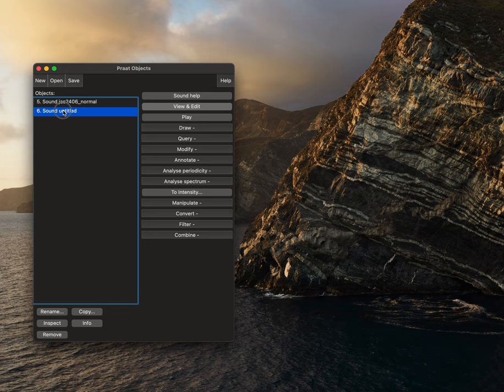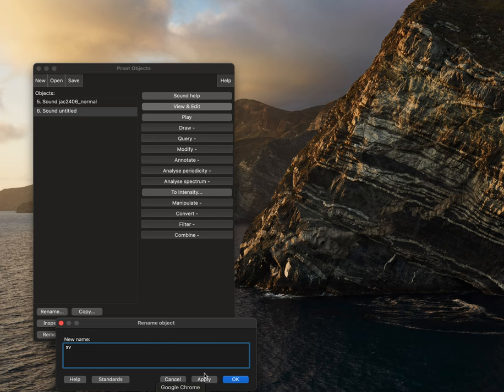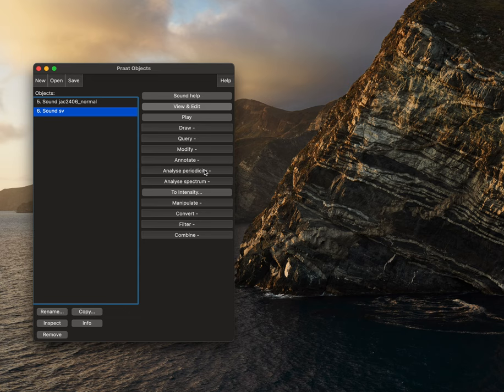We'll find the file right here. It's the new untitled file. And we're going to rename this as SV for sustained vowel, and this should be lower caps. We'll then select okay.